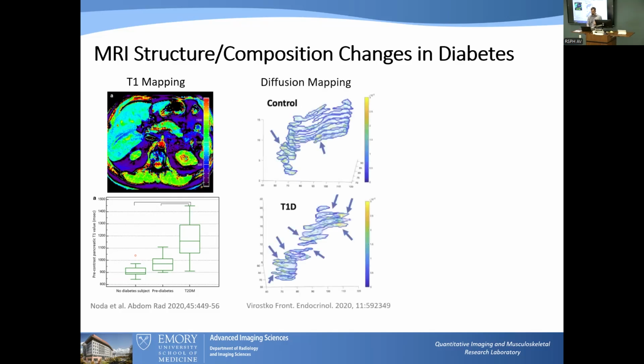Another thing that can be measured is the apparent diffusion coefficient of water within the tissue itself. This is a technique that MRI allows us to use, with water as a molecular probe of how tightly spaced different parts of the tissue appear.